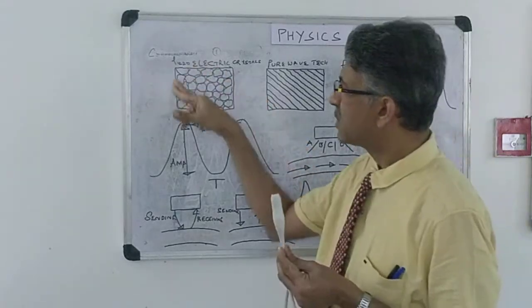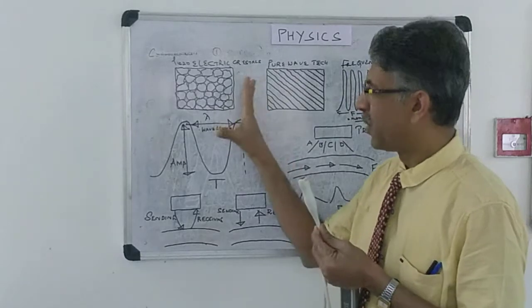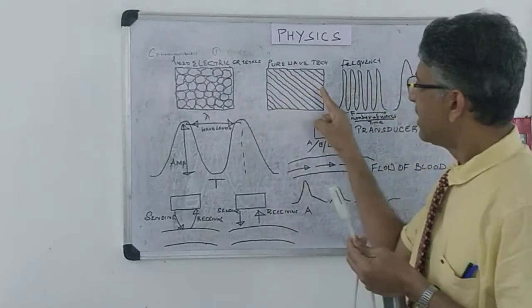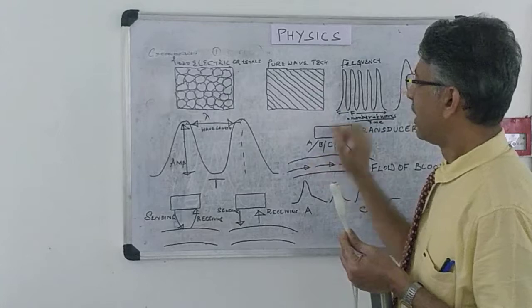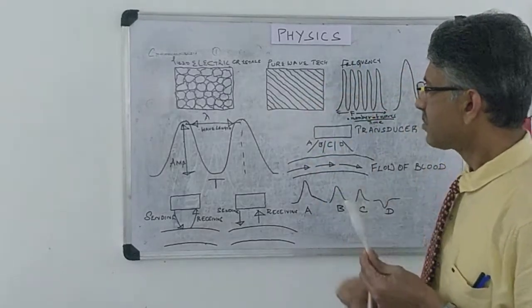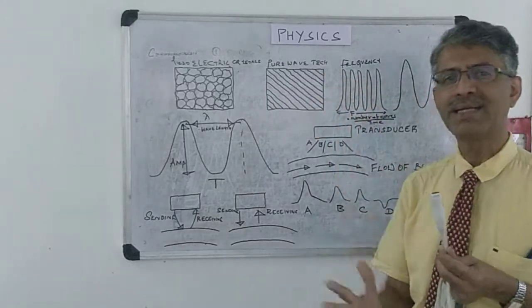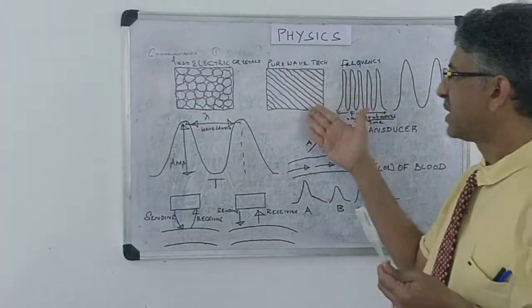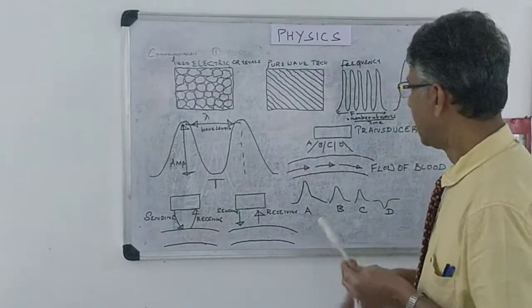If you see the conventional piezoelectric crystals, they are not well organized. And what we see nowadays is called pure wave technology, where the crystals are pure and very regular. These piezoelectric crystals are precise, so they give a good quality, precise image. So most of the recent ultrasound machines use a technology called pure wave technology.